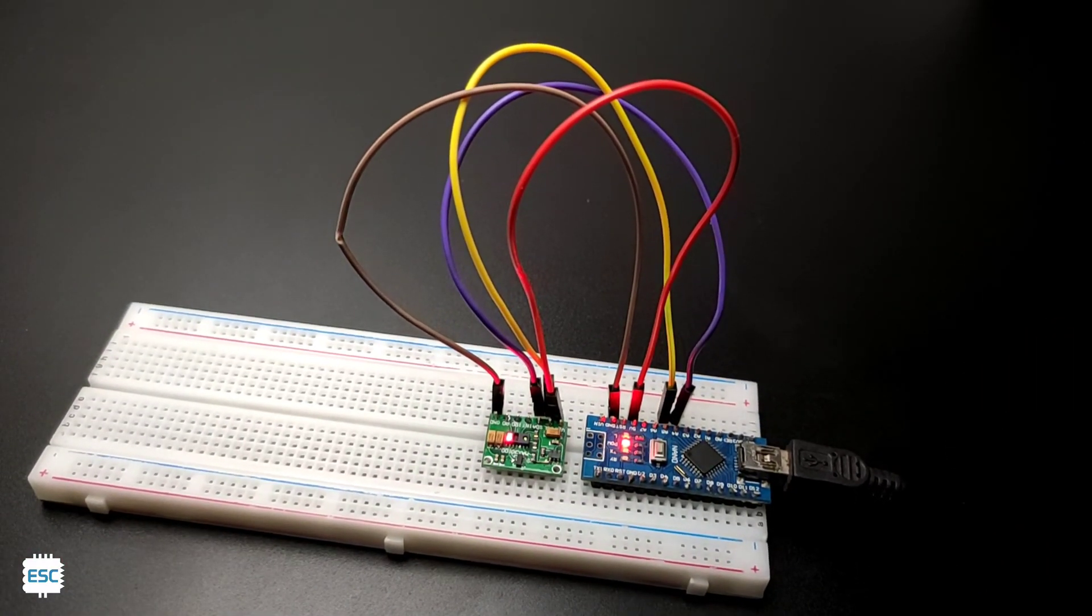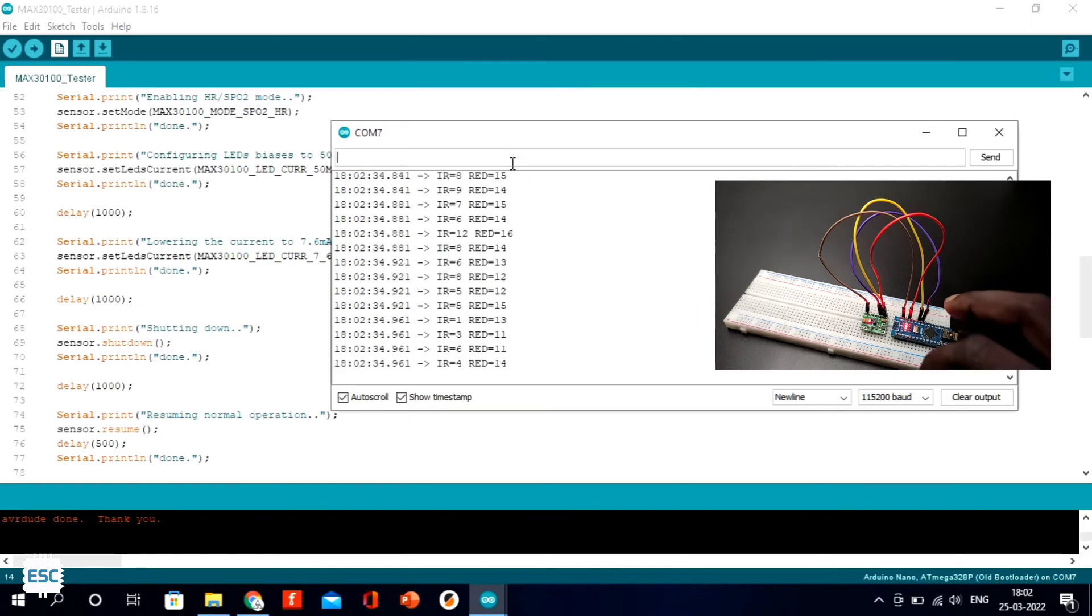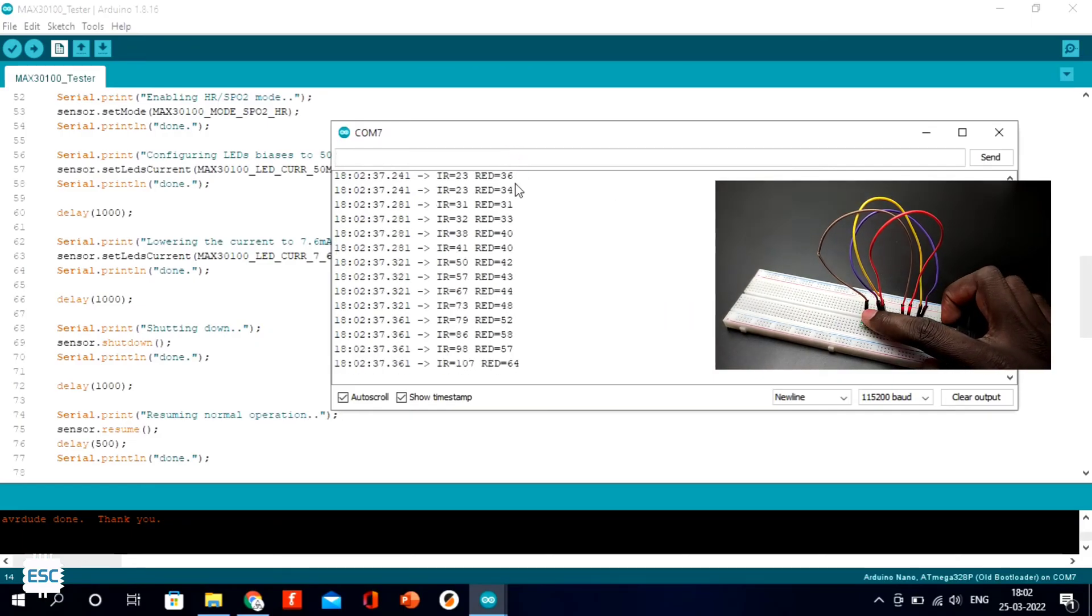And in the serial monitor, you can see the reading, so it is working perfectly.